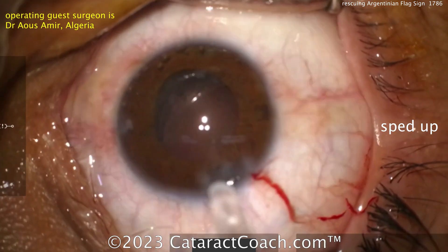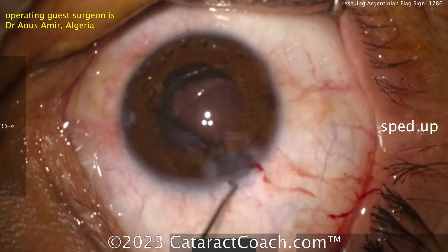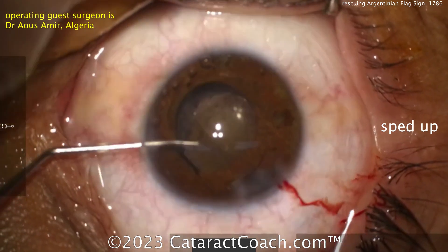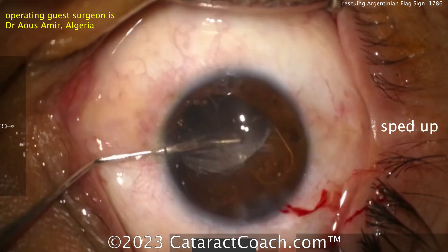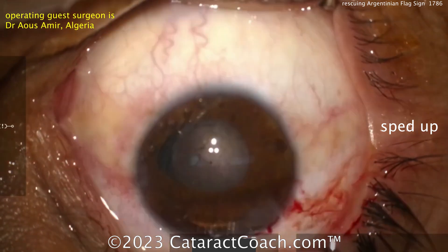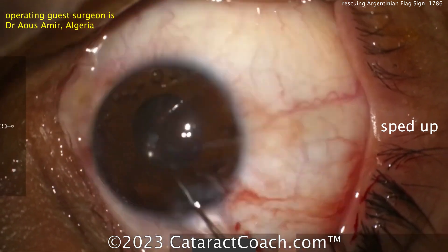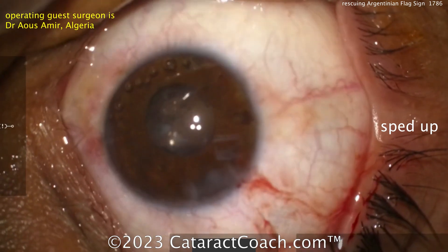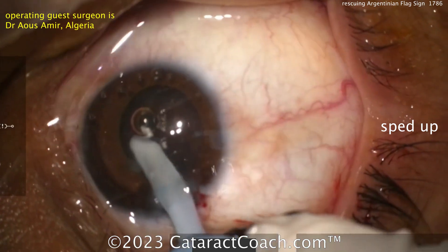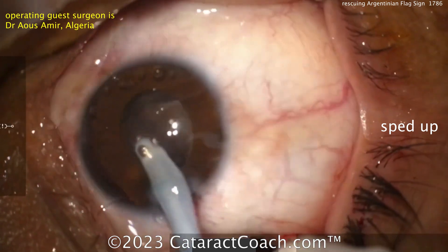Looks pretty good — let's get the lens in. Now, be very cautious putting the lens in the bag: not too much manipulation because that rip you have — you don't want run-out. This case is using a lens with four haptics. In general for a case like this I'd prefer a hydrophobic acrylic lens with two haptics, because I could keep it rolled up tight, deliver that tightly rolled lens into the bag, and just let it slowly open — no manipulation needed to position the lens or tuck in haptics.